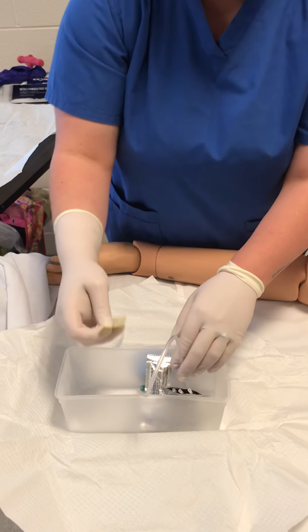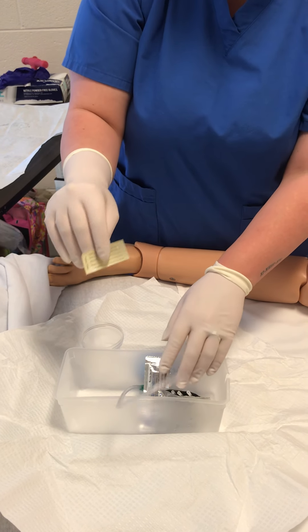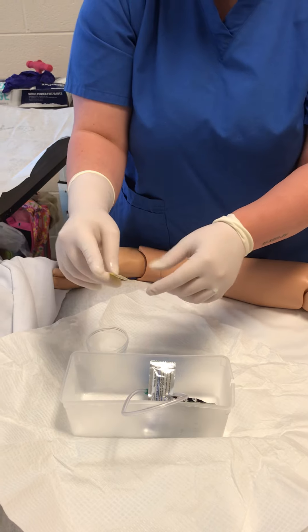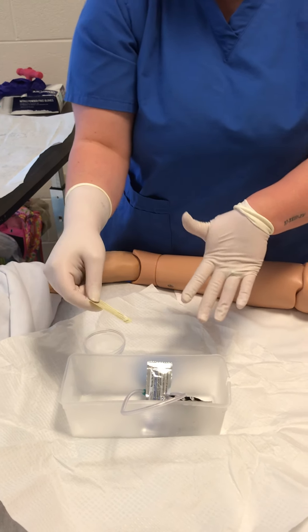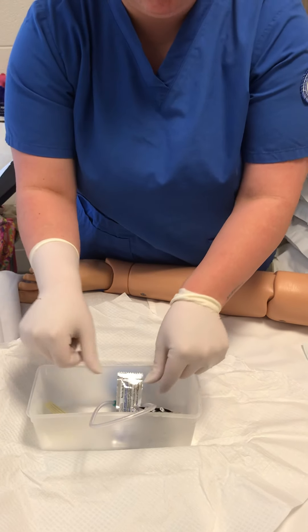Here's the sticker or the label for my cup. I would make sure that the patient's name and the date and time and all that was correct on it, and verify it with the patient.